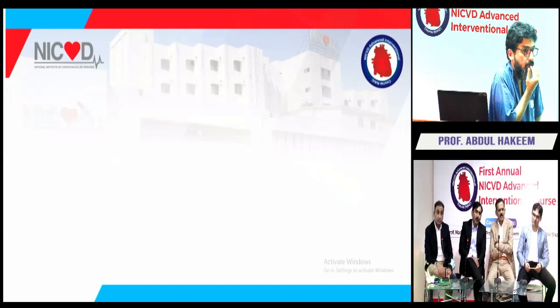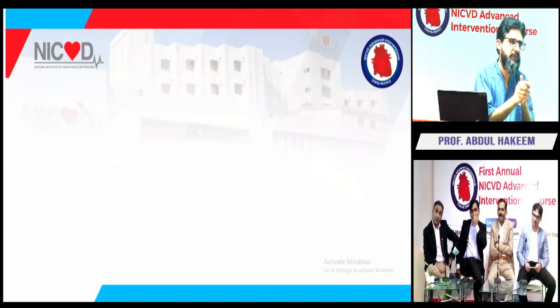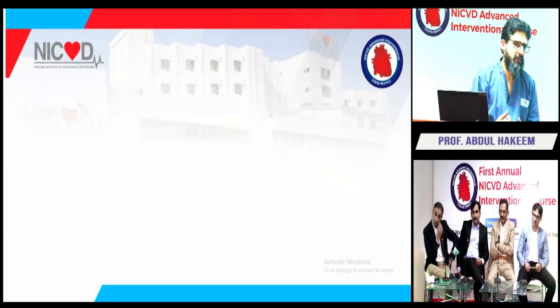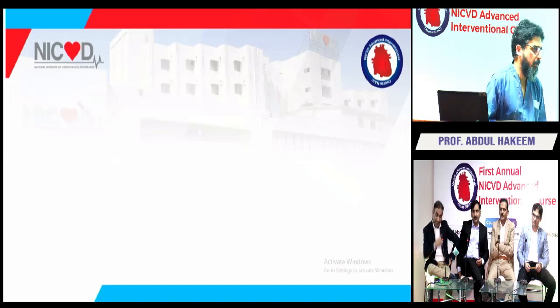Let's try to take a guider and then a guide extension. The patient's in VFib, dude. You can't do that in your acute MI patients when they're in VFib, let alone this. So this has happened in our earlier experience at least a couple of times. The first few times it happened, we mandated that we would have ECMO in the room. So you have big sheets, you pull everything out and you just put the patient on ECMO. Patient goes on ECMO, patient lives.